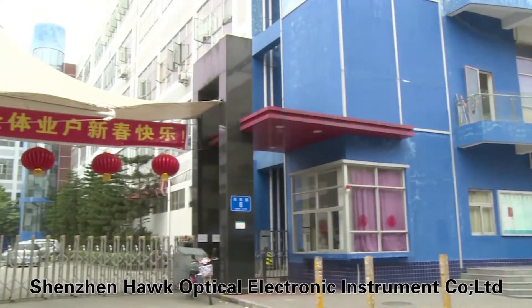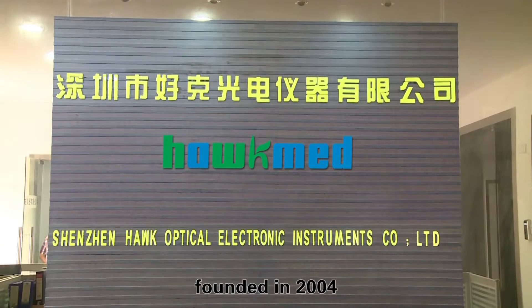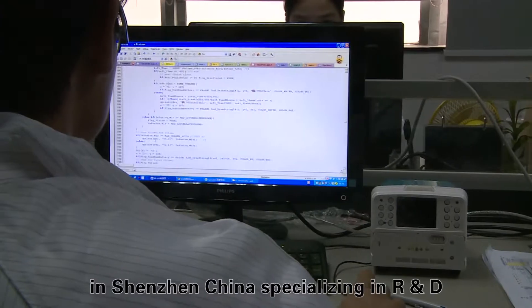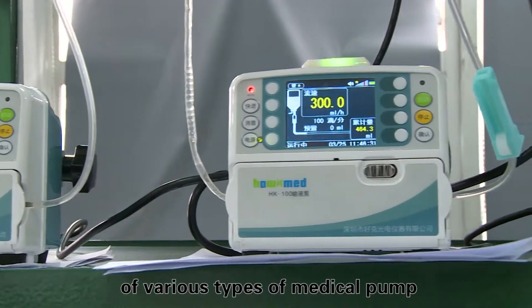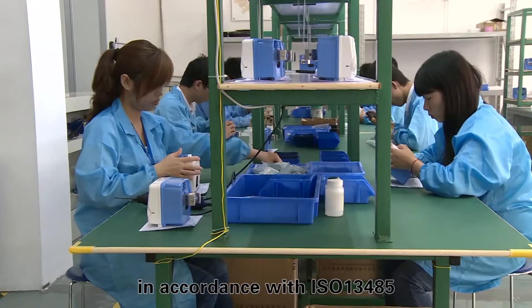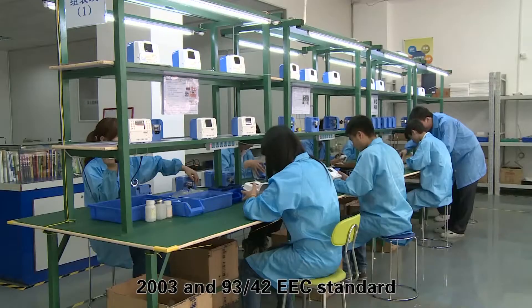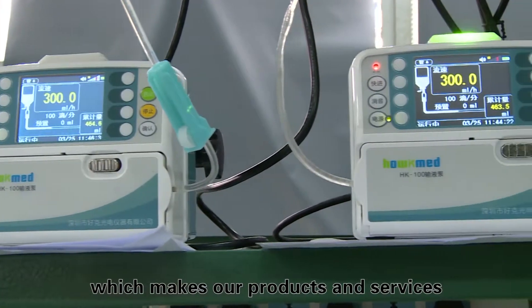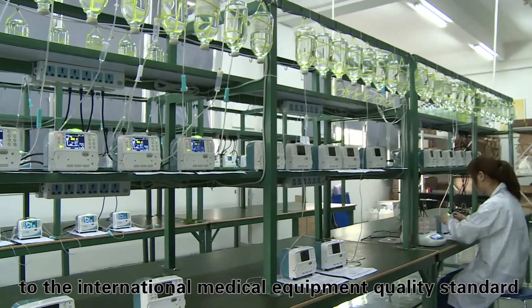Shenzhen Hawk Optical Electronic Instrument Company Limited, founded in 2004 in Shenzhen, China, specializing in R&D, production, and sales of various types of medical pumps. We manage strictly in accordance with ISO 13485:2003 and 93/42/EEC standards, which made our products and services reach the international medical devices quality standard.